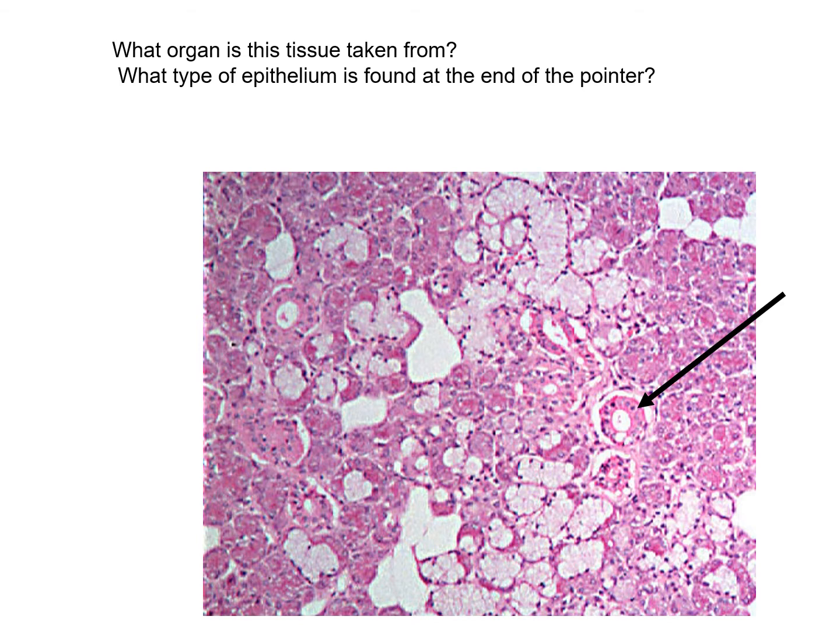I just talked about this one. This is a salivary gland too? It is. Okay. Not two. This is the first time I've shown you a salivary gland today.